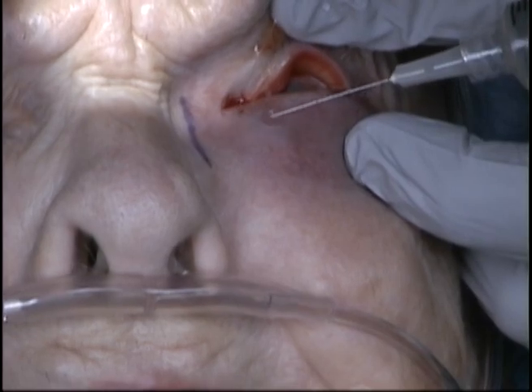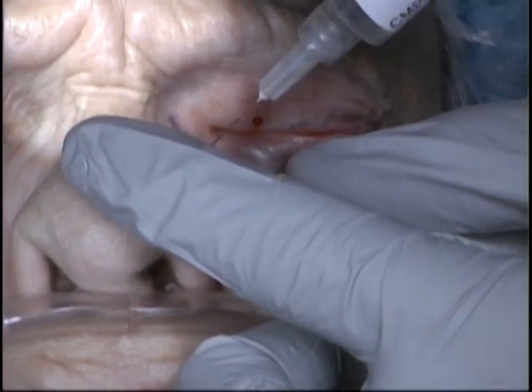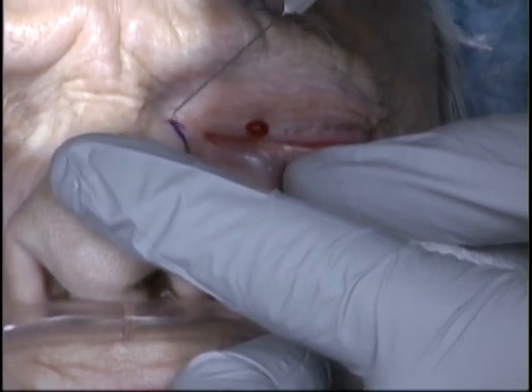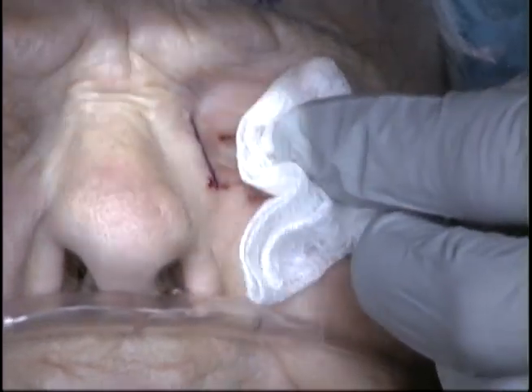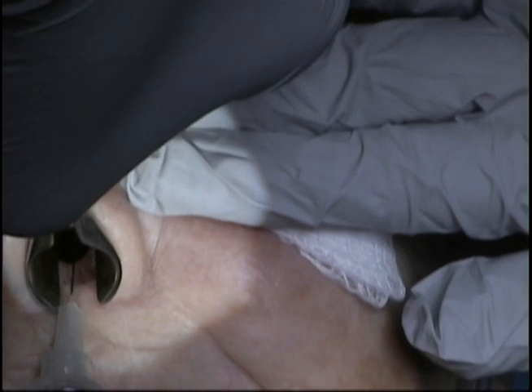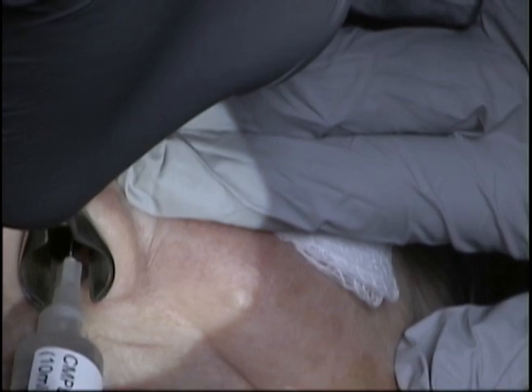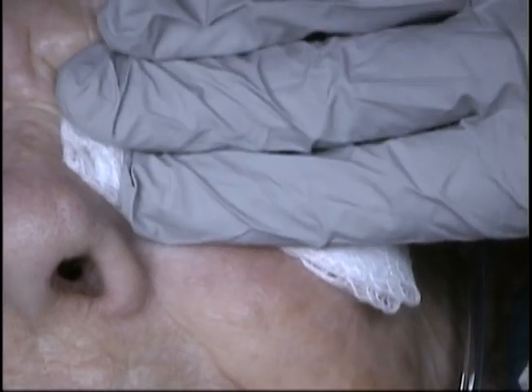The same mixture is then placed along the marking. Local anesthetic will then be placed intranasally in the area of the nasal mucosa of the middle meatus. This will allow for a comfortable awake DCR for the patient as well as excellent hemostasis.